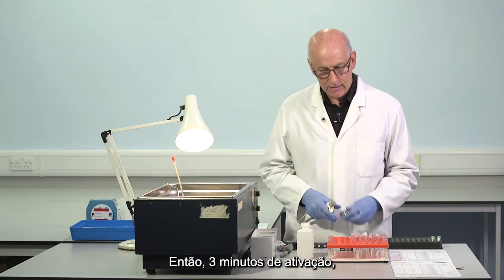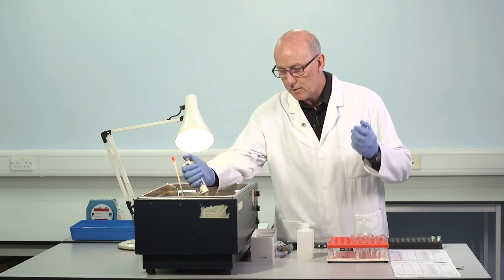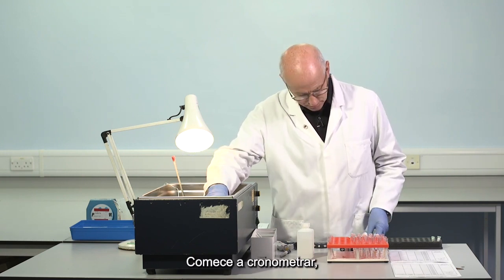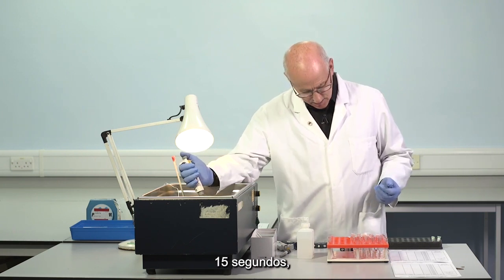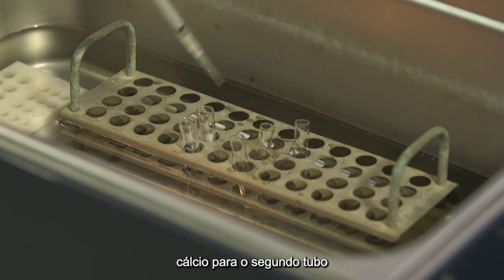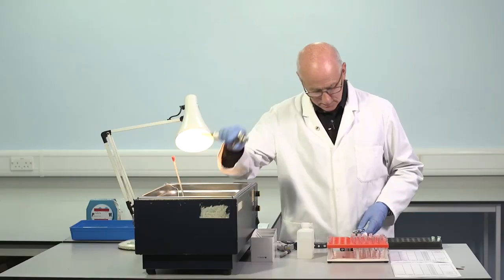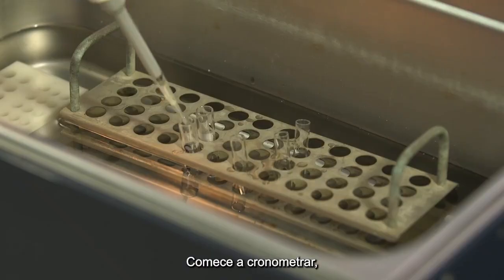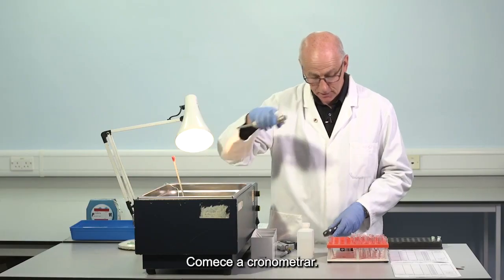So, 3-minute activation, calcium to the first tube, start a stopwatch. 15 seconds, calcium to the second tube, start a stopwatch. 30 seconds, calcium to the third tube, start a stopwatch.